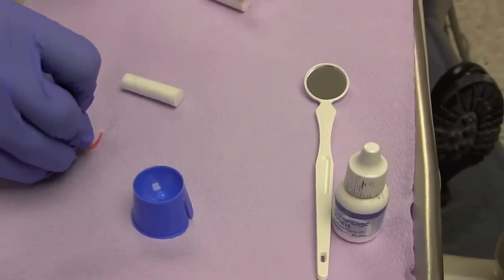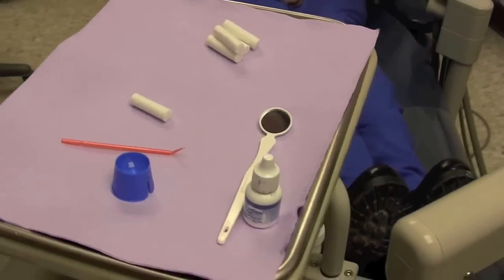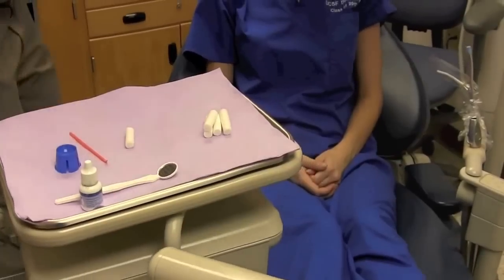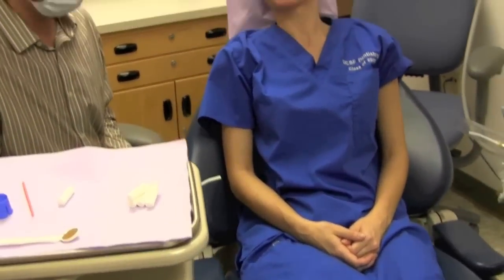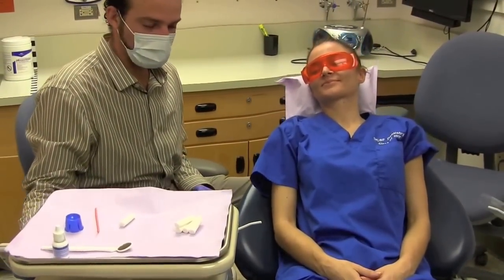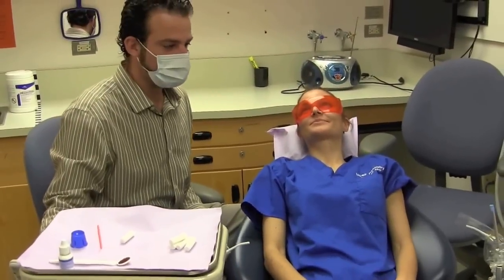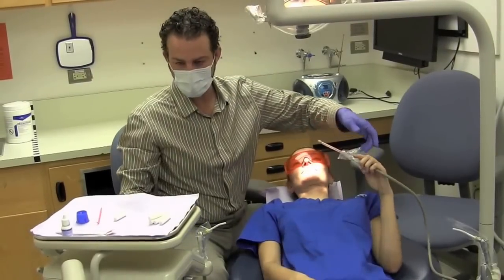I'm going to pre-bend our micro brush, then apply the drop to our friendly patient. Okay if I lean you back? Yes. You want to hold it for us? Thank you so much.